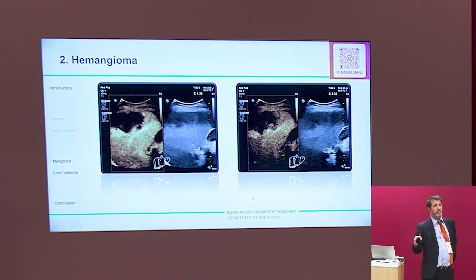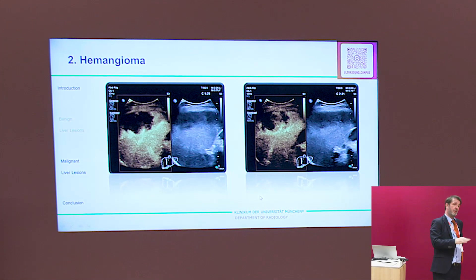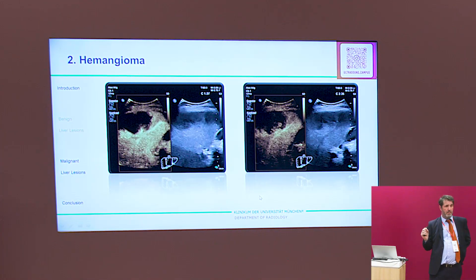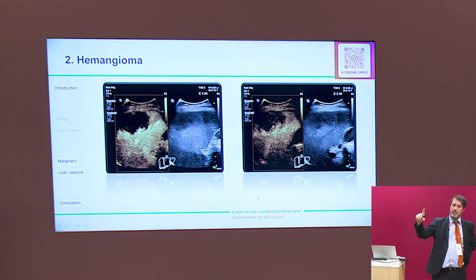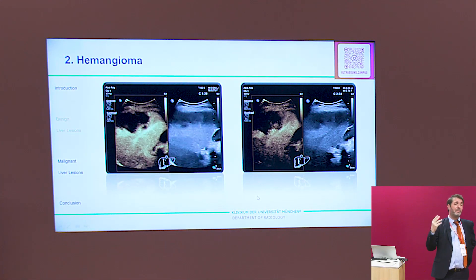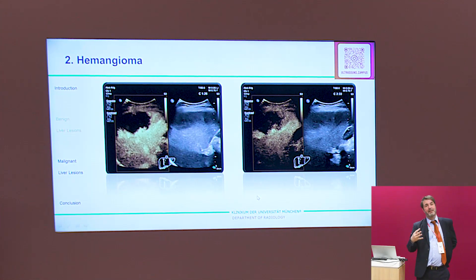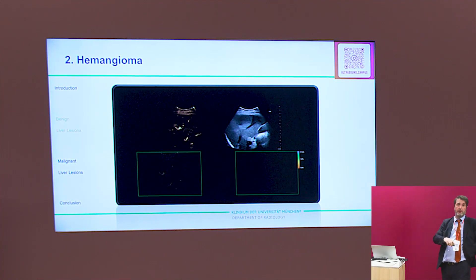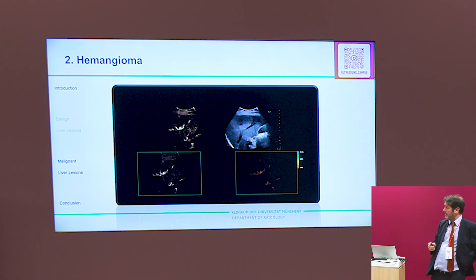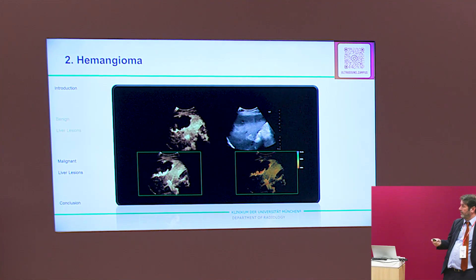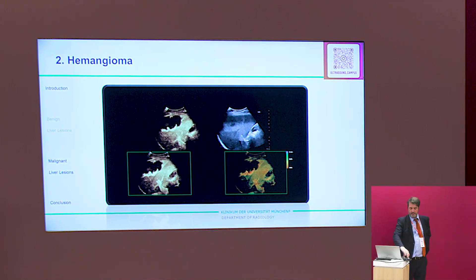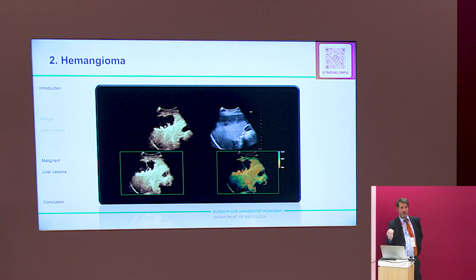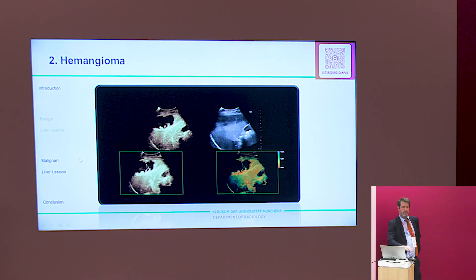After two and a half minutes in the portal venous phase, the perimodular nodules have grown and grown. This is a big hemangioma with some thrombotic changes. Diagnosis costs 20 Euro — immediately, no need for biopsy, and the confidence is equivalent to MRI with liver-specific contrast agent. For beginners, the best target lesion is 6 to 10 centimeters in depth. The summarized clip with time-of-arrival shows red at the periphery — meaning strong early uptake — confirming hemangioma with thrombotic changes.